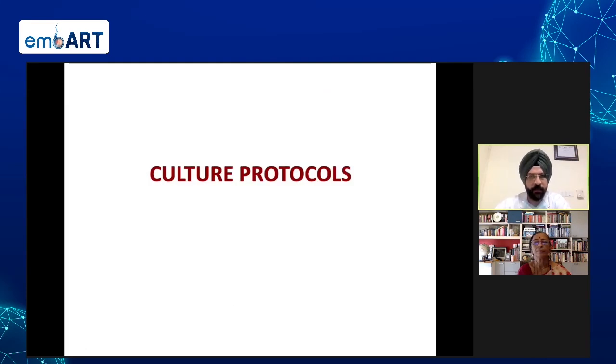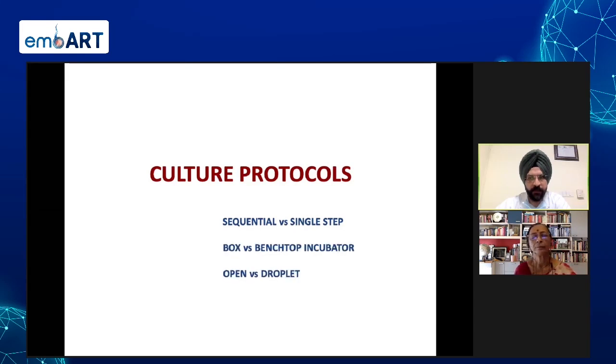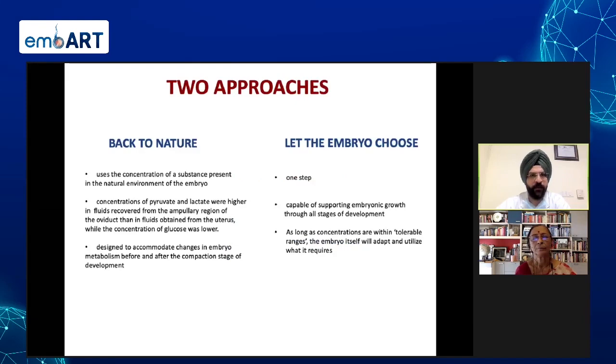A brief discussion about the culture protocols. We'll just touch upon sequential versus single, open versus droplet, and humidified culture. Now, there are two approaches. I'm not going to go into the details. One is the back to nature approach, and the other is the let the embryo choose approach. Back to nature is the sequential, which I discussed in detail at the start of the discussion. And let the embryo choose is a single step, which is nowadays very common, especially with people who are using time lapse.